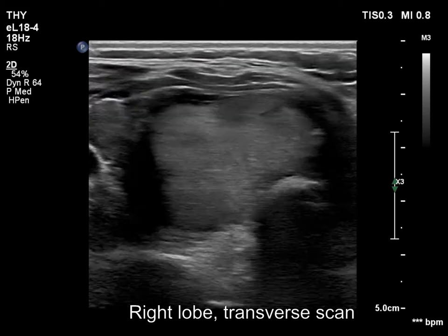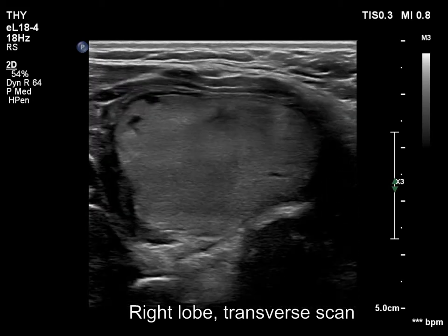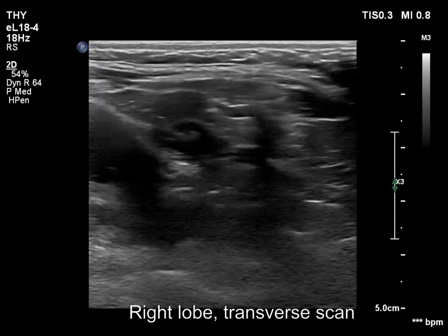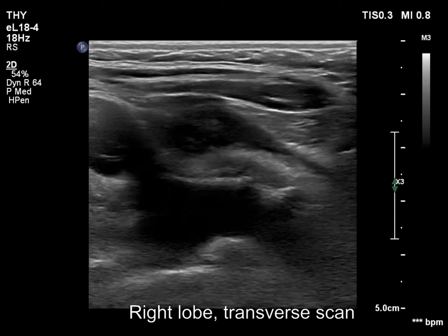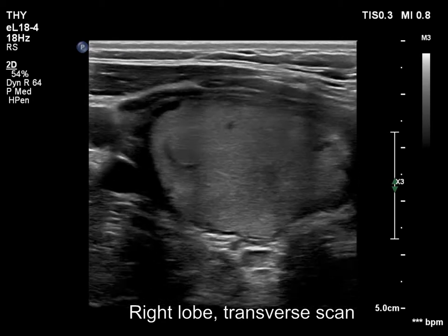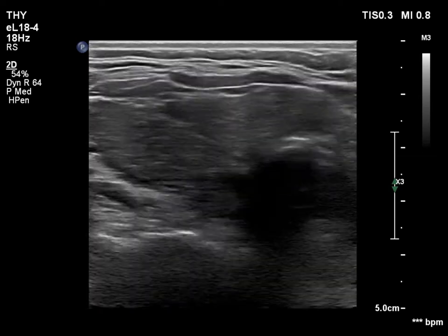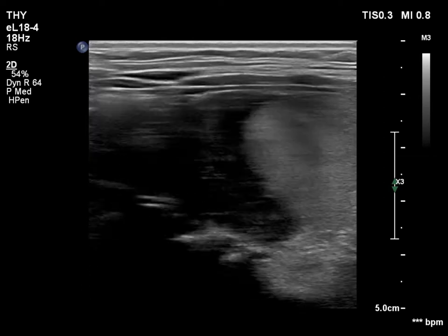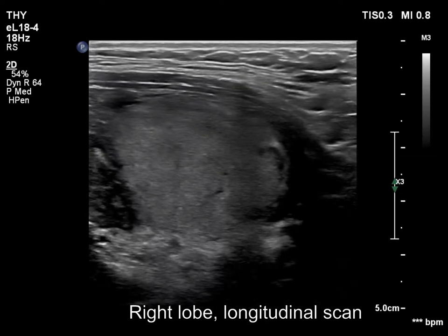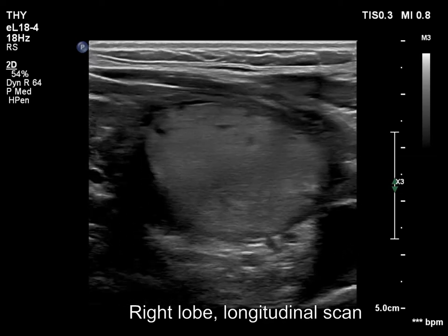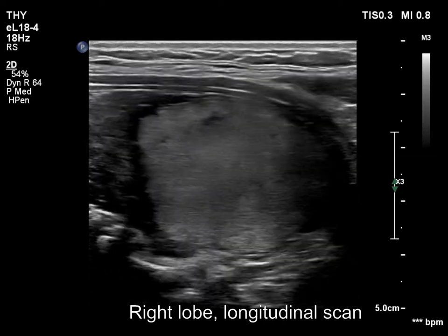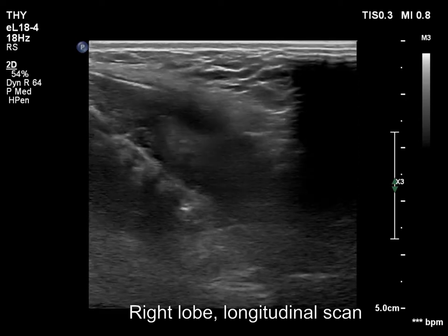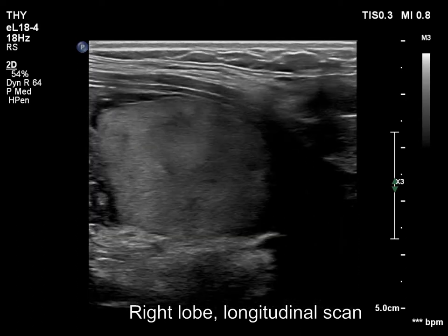The thyroid is moderately hypoechoic and inhomogeneous, corresponding to the underlying Hashimoto's thyroiditis. There is a large hyperechoic nodule in the lower two-thirds of the right lobe. Although the borders are not regular, in the presence of thyroiditis, these irregularities are usually caused by the infiltrative nature of the autoimmune process and should not be regarded as pathological.